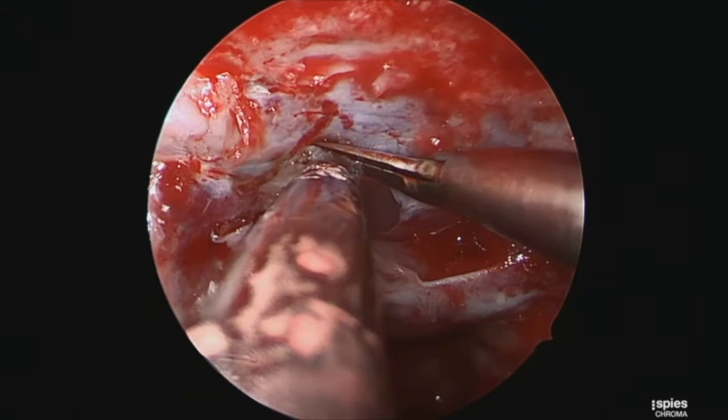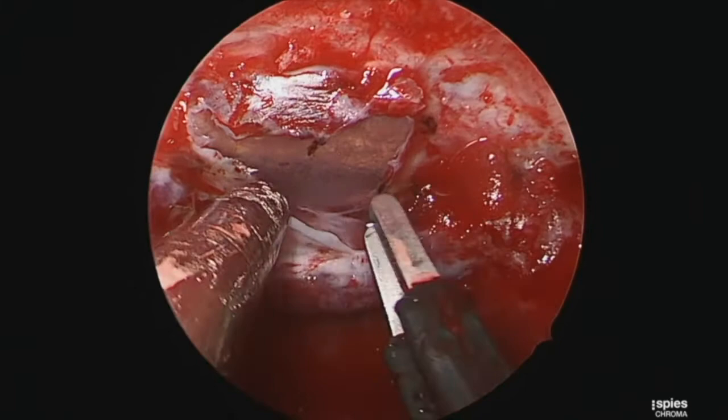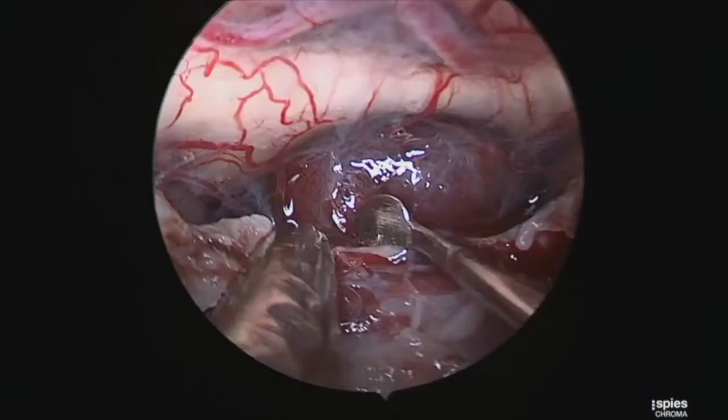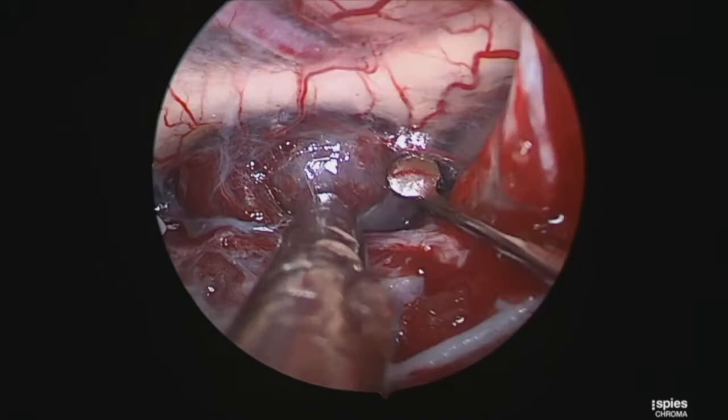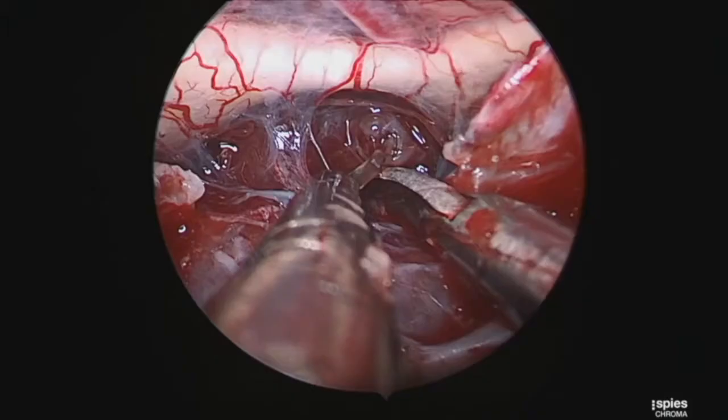The superior intercavernous sinus is then packed off, and we open across it to see the top of the gland below and the chiasm coming into view above. This cruciate opening into the suprasellar space is very limited and directly centered at the superior intercavernous sinus, giving us a beautiful view of the suprasellar space. Indocyanine green fluorescence angiography under the endoscope shows the chiasmatic perforators, which we take care to preserve when addressing the tumor.